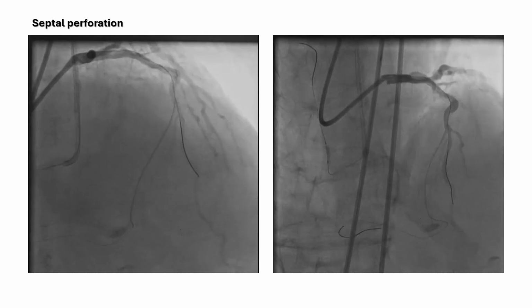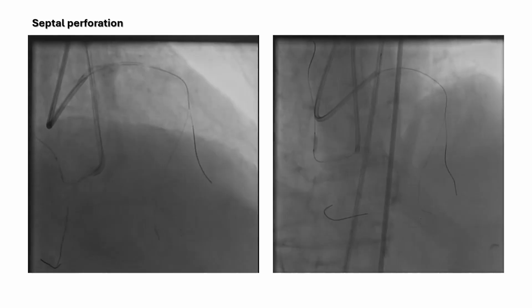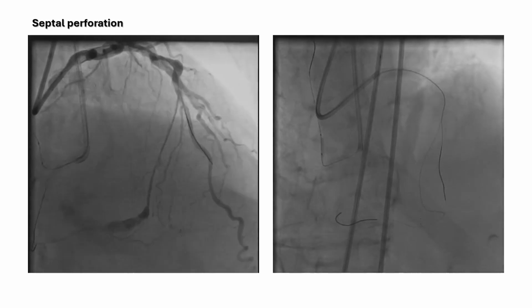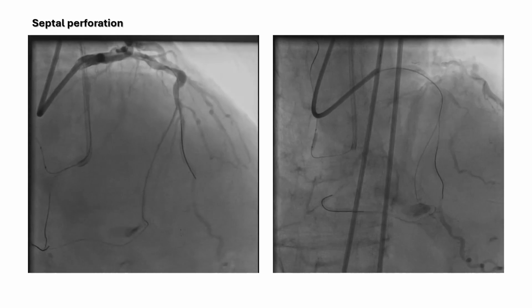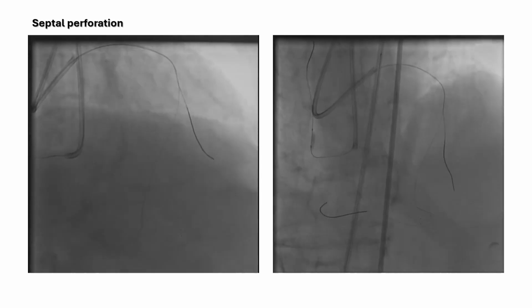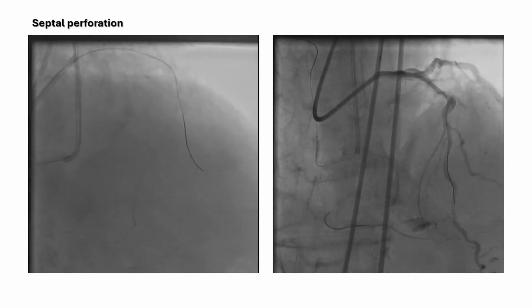However, after balloon dilatation, we observed a perforation of the septal branch. It was an Ellis Type 3 perforation. At this stage, we inflated the same balloon at the perforation site to limit the perforation.